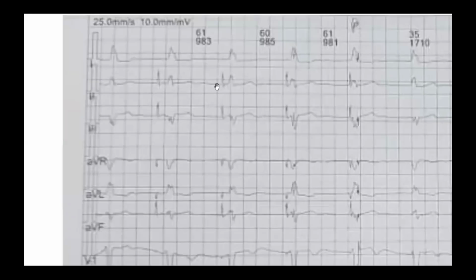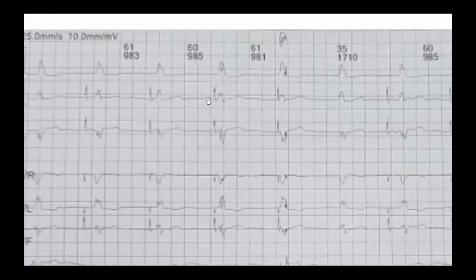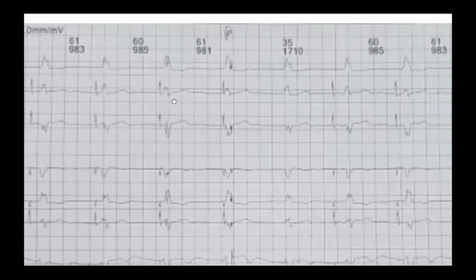So that was the case. He tested the atrial lead alone, he tested the ventricular lead alone, he tested sensitivity. Everything was perfect. So how do we solve this problem? We made the lower rate 70 to overcome the junctional escape rhythm and to preserve the AV synchrony of the patient. Do you have the ECG after correction?